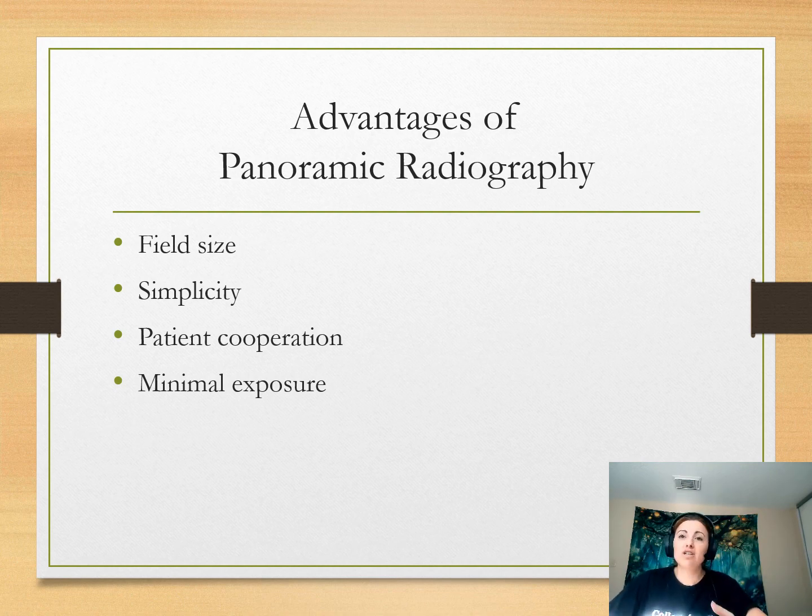And then learning how to take the panoramic is pretty easy. It's very straightforward. You get your patient in there, line them up. There's a light. Usually it's pretty easy for the radiographer to get them set up. And most patients actually prefer taking a panoramic to the intraoral because they're more comfortable, right? You're not putting very large sensors into their mouths.